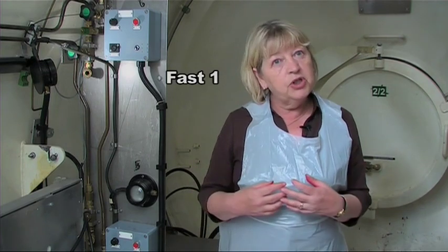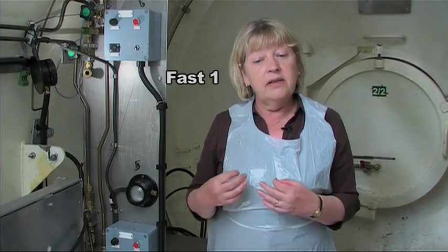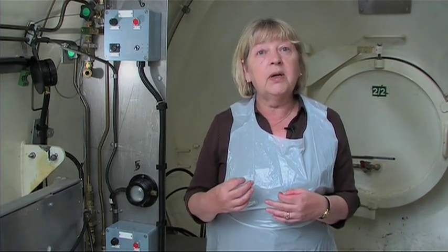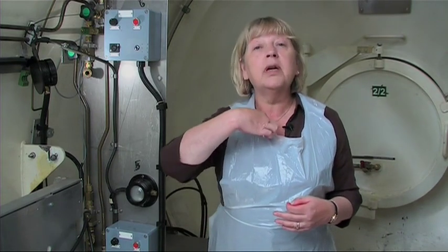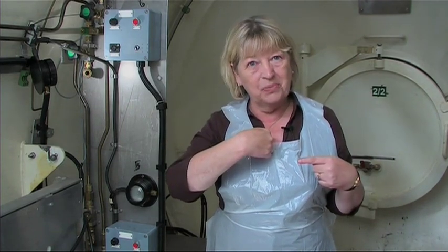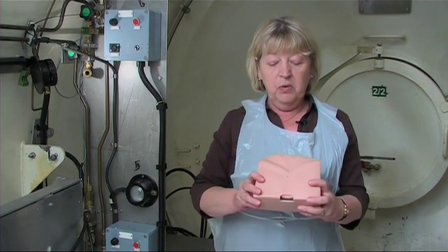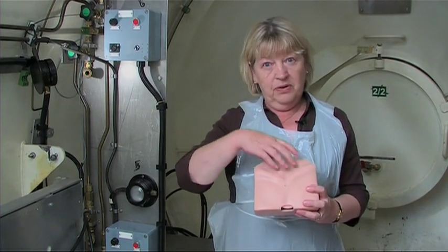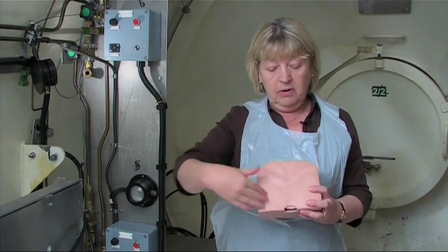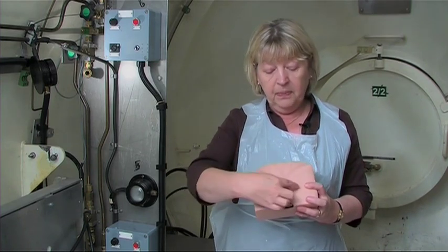The system I'm going to show you is called the Fast 1 system. And in this system, we put the cannula into the sternum. So that's the bone here, just in the middle of your clavicles and somewhat below it. We use a model for training purposes, and I want you to imagine that this is the patient's sternum, this is their throat, their clavicle and the sternum.